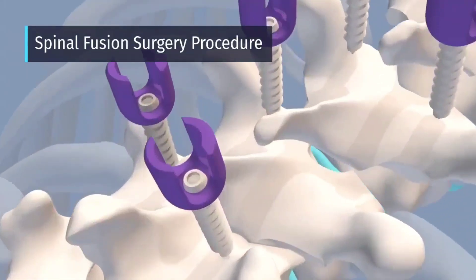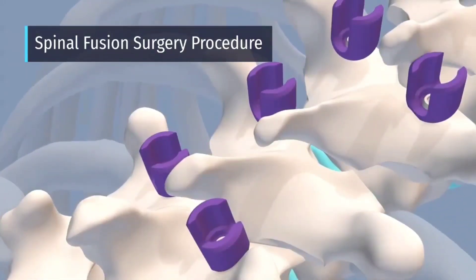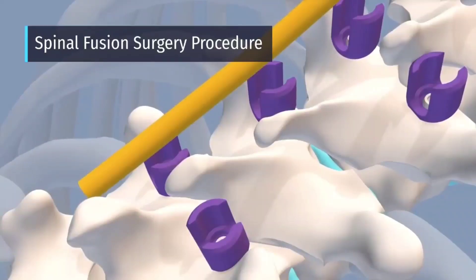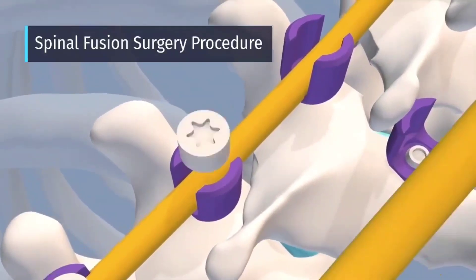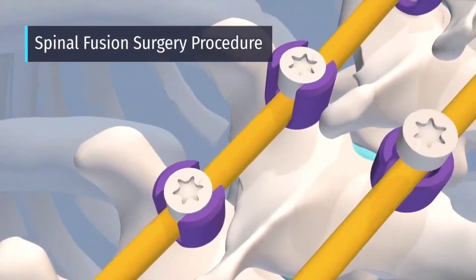Next, screws and/or hooks are attached to the vertebrae at the curved section, and the rods are attached to the screws or hooks. These screws and hooks act as anchor points to secure the rods.